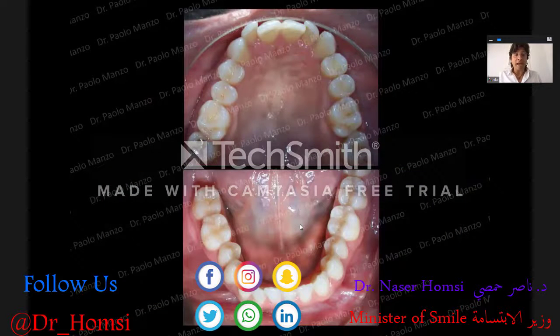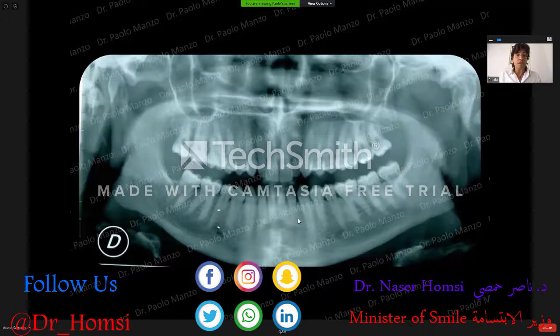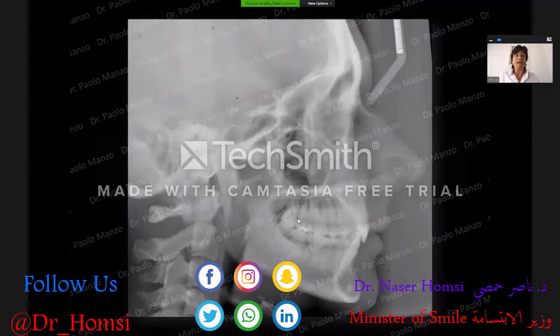Now we have a small crowding at the upper and a very small crowding also at the lower. This is the panoramic X-ray and the lateral head film. On the lateral head film, you can see the typical inclination of the upper incisor. Usually, these kinds of patients don't lack bone support. They have a good level of bone, a good mandibular symphysis, and it is wide. We don't have the typical situation of class 2 division 1 or skeletal class 2. This is a situation with biretrusion of the upper and lower incisors, so we need to expand the upper and lower arch, also sagittally.